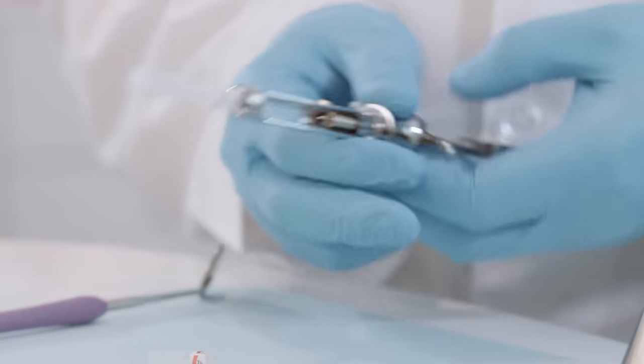Locate the greater palatine foramen. Direct the syringe from the opposite side of the mouth with the needle approaching the injection site at a right angle. Place the bevel against the soft tissue at the injection site. The needle must be well stabilized to prevent accidental penetration of the tissues. With the bevel lying against the tissue, apply enough pressure to bow the needle slightly, then deposit a small volume of local anesthetic. Straighten the needle and permit the bevel to penetrate the mucosa. Continue to deposit small volumes of anesthetic throughout the procedure, maintaining pressure with the cotton-tipped applicator. The greater palatine nerve block is now complete. Probe gently for the greater palatine foramen and, after locating it, very slowly advance the needle into the greater palatine canal to a depth of 30 millimeters. Aspirate in two planes. If negative, deposit slowly 1.8 milliliters of solution over a minimum of one minute. Withdraw the syringe and wait a minimum of three to five minutes before starting the dental procedure.